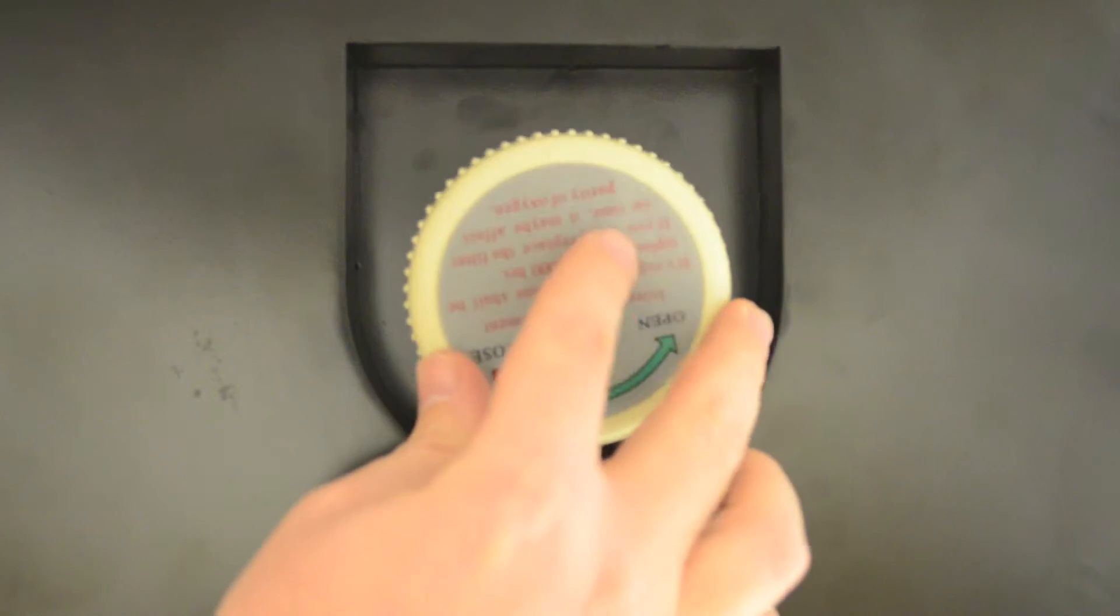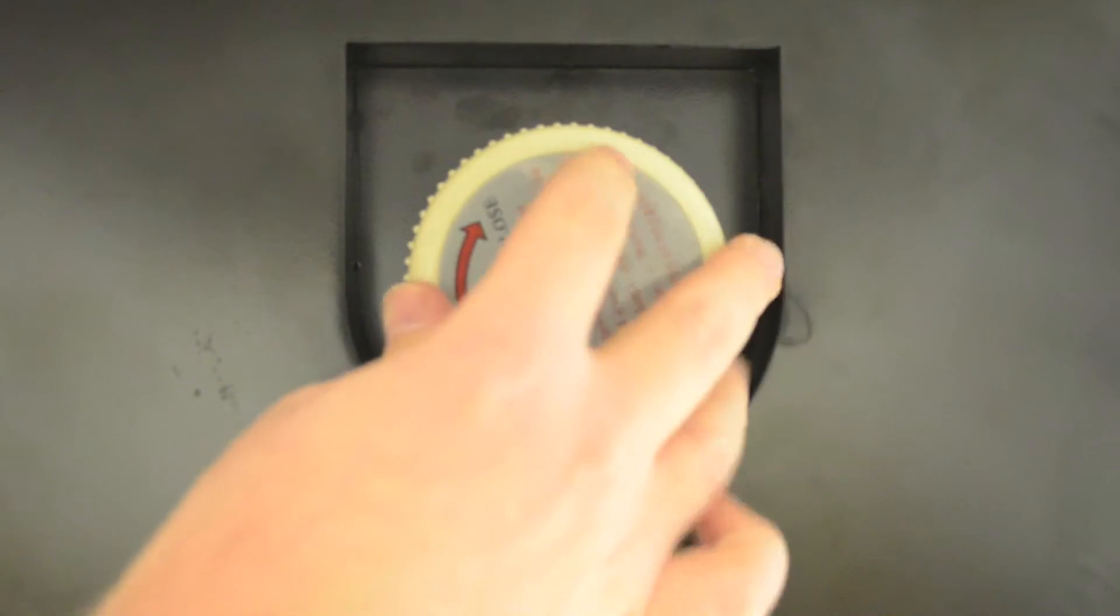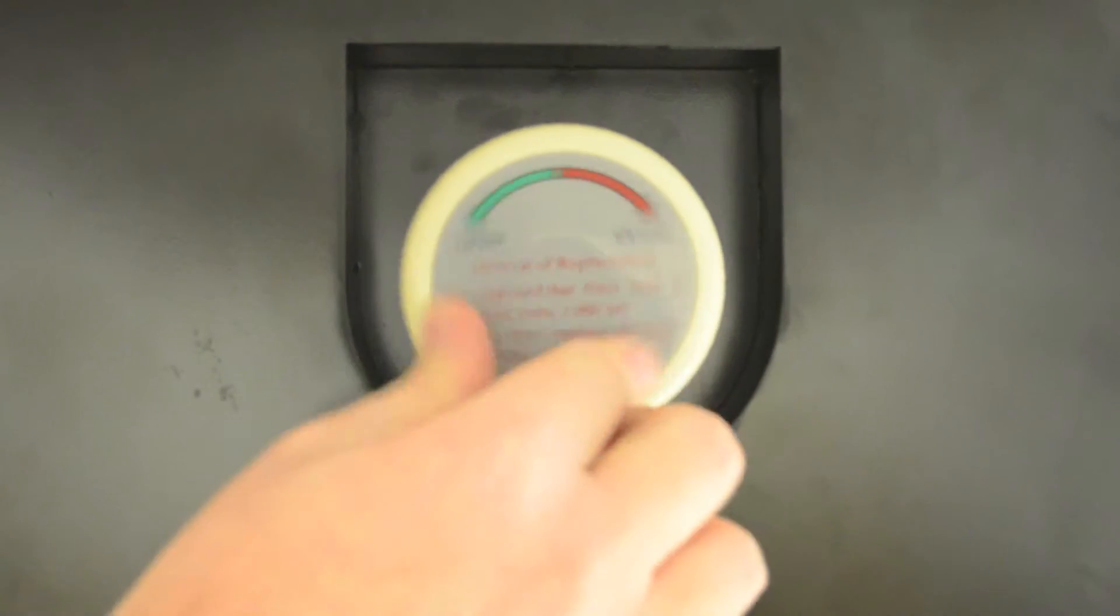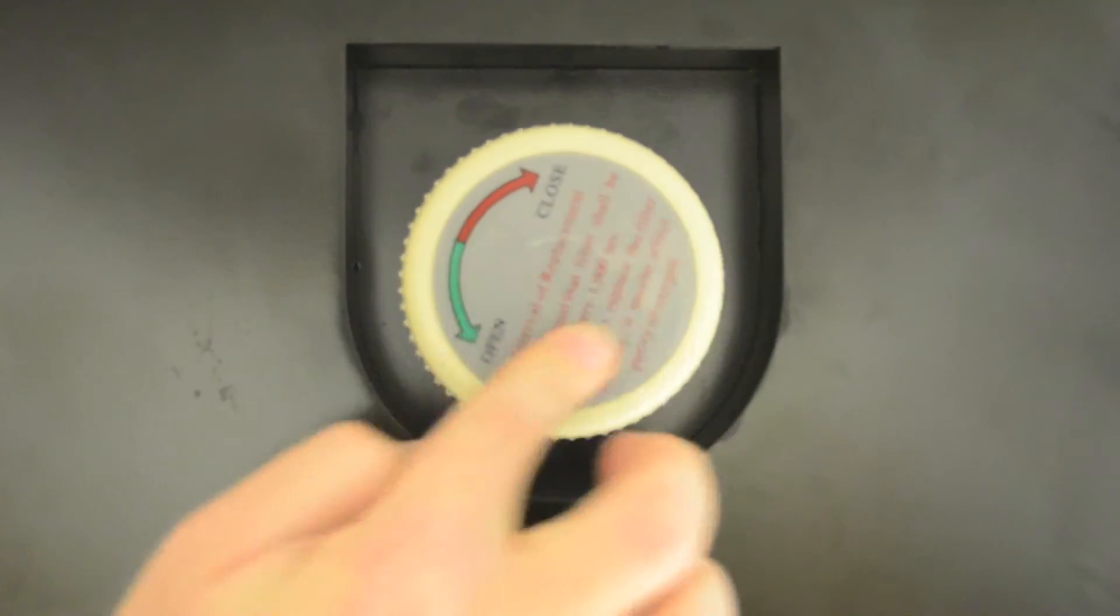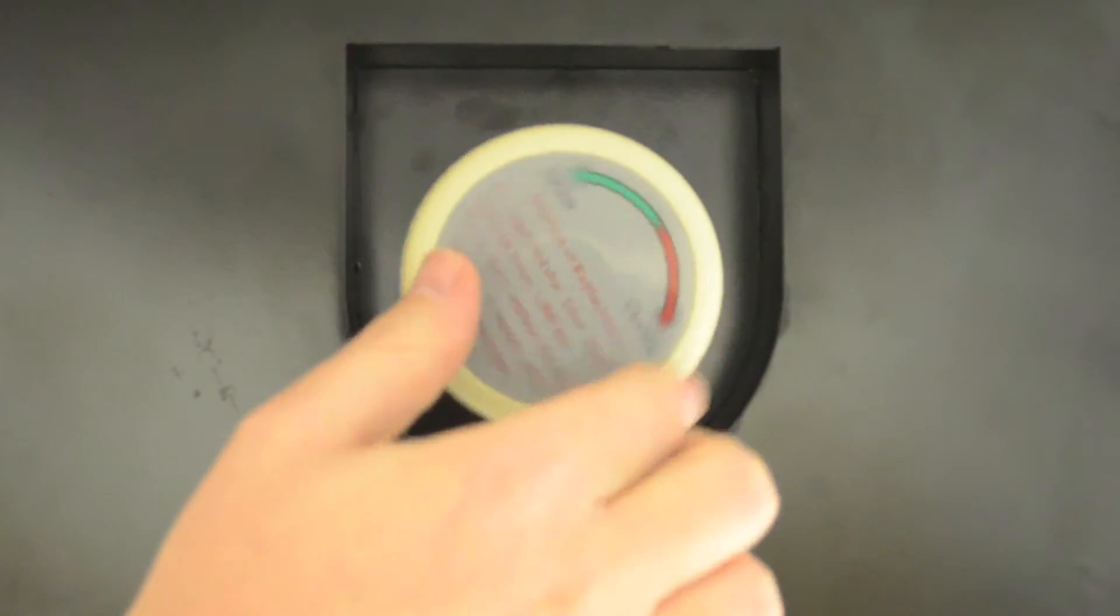Once the filter has been replaced, just screw the cover of the filter back in place.